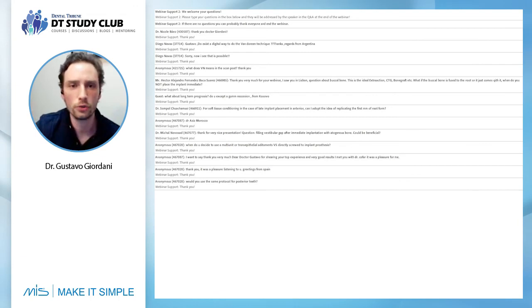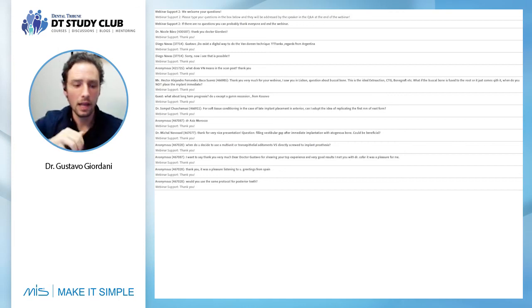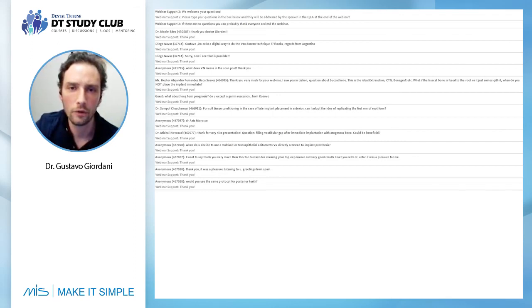But what the literature shows and what we have in our experience is, when you use a connective tissue graft, when you have more than 2 millimeters, when you have the biomaterial there, when you have the implant in the correct position, and you have a good emergence profile to support everything, and you don't push the tissue in the horizontal direction, you don't expect a recession. This is really safe for our patients, but you need to respect the protocol. If you don't respect it and you miss one or two steps, you can have recessions in the short, medium or long term of your case.